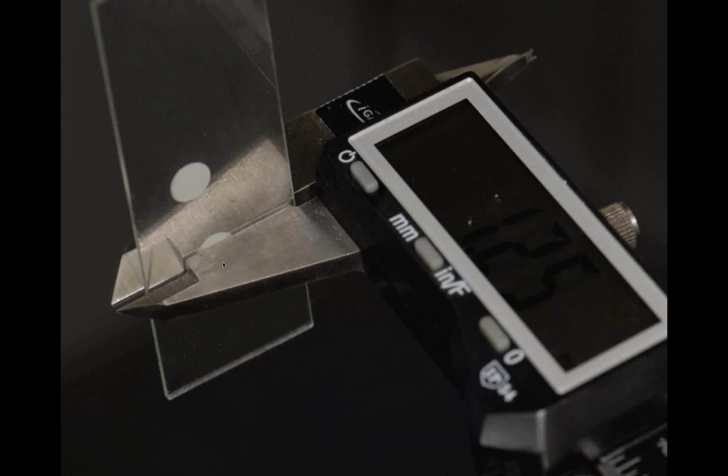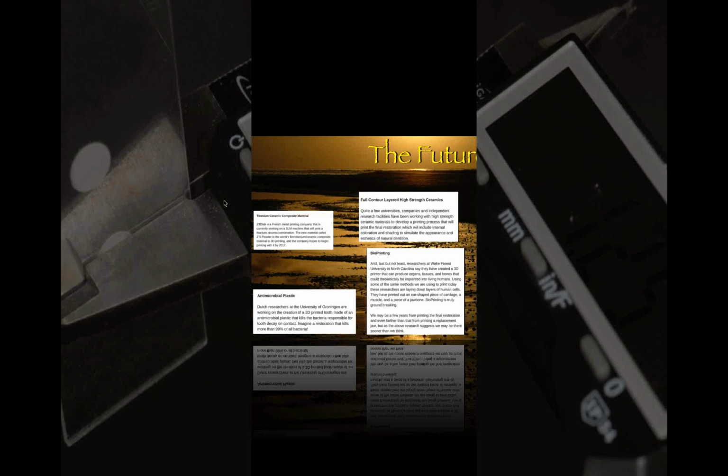And you plug that information in to some calculations, and that again goes into a material file, which tells the computer inside the printer exactly how to expose any resin properly. Now, it takes a little bit of time to do this, but the end result is you can create a custom material file for any resin that you want to print that you run across out there, probably in about 30 minutes. Okay, you can do it. All right, so you just need really good calipers to 3 decimal points and some glass slides, and boom, you're done. The functionality is built into the printer.